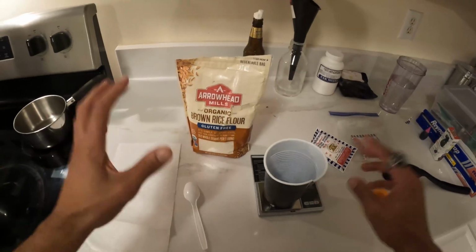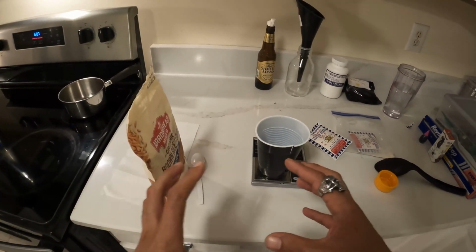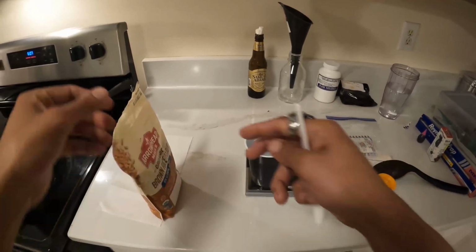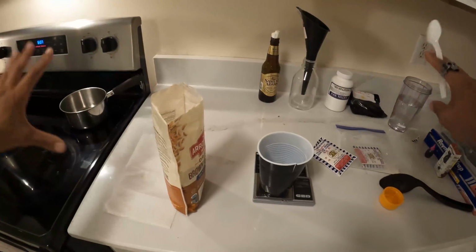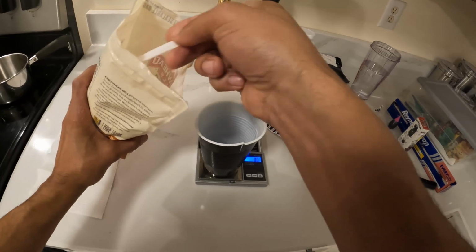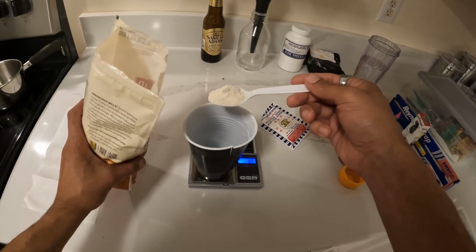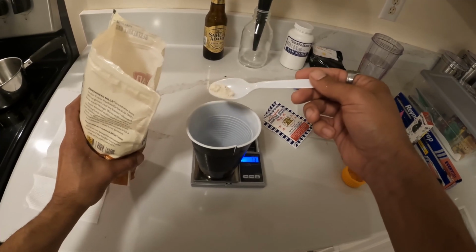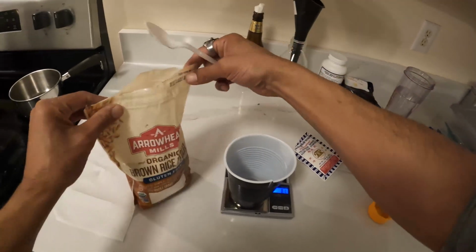So for this recipe, it's about the same. I don't really like to load it up with nutrition. I like the mycelium to search, and if there's just too much nutrition, it could maybe stall that initial growth, because all the food's right there and we want it to stretch and to grow and look for its food source. So even though I'm doing 500 milliliters, I'm not going to do 10 grams of brown rice flour. I'm going to do about 8. I've even done like 7.5 before, but that's 8.1, which is fine.